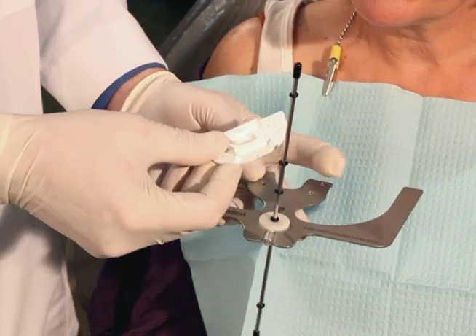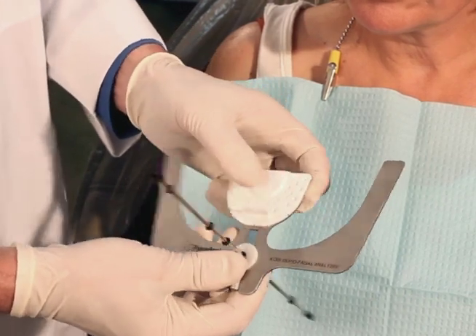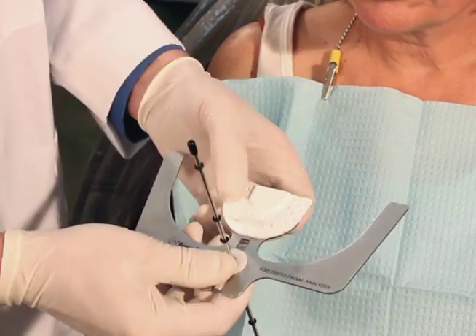Next we can add the Coyce Index Tray. The Coyce Index Tray has little pins on the bottom that index through the holes in the bite plate, and we want to make sure it's seated all the way down against the plate.